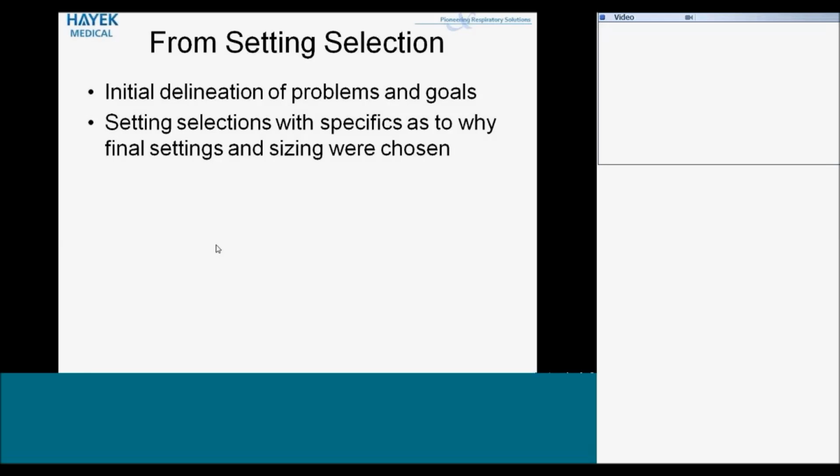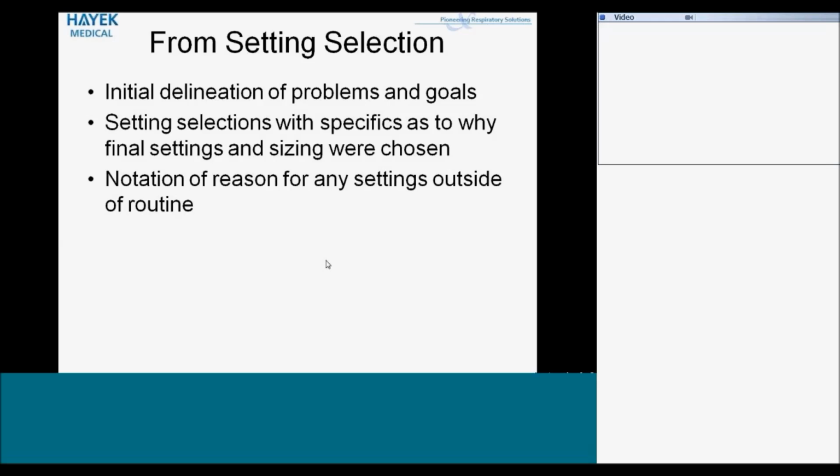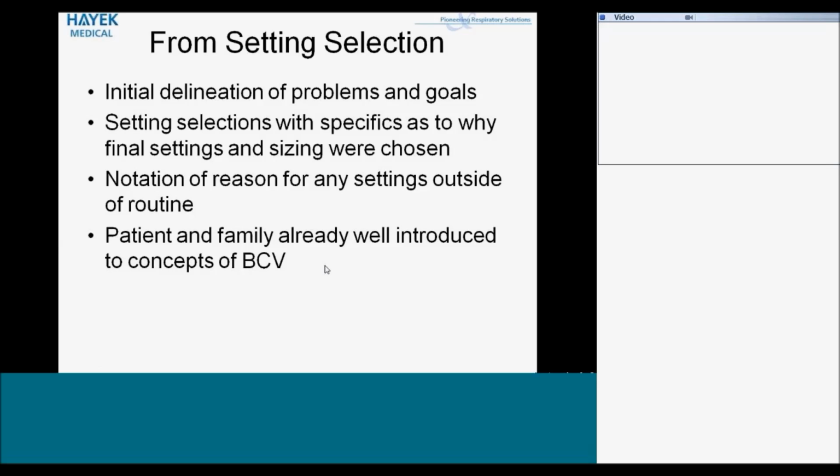Your settings and why they were chosen should be documented, particularly if any of those settings fall outside of what we consider normal settings. You should have notes as to why they were selected and why they're being used to help you determine going forward if those are the right settings for the patient. Any reasons, like I said, the settings are outside the normal range.